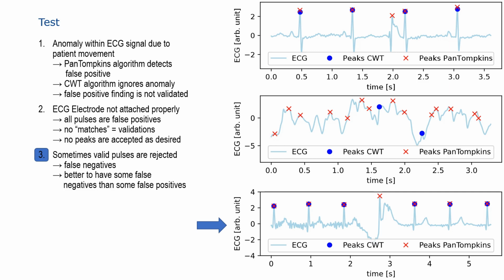Finally, you can see the case where a valid pulse is only detected by one of the 2 algorithms. This happens sporadically but very infrequently. Therefore, this shortcoming is bearable for our analysis.